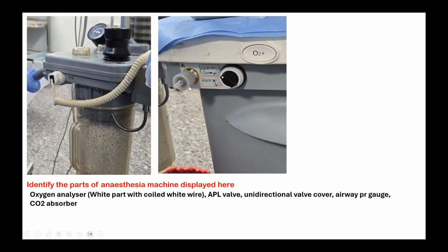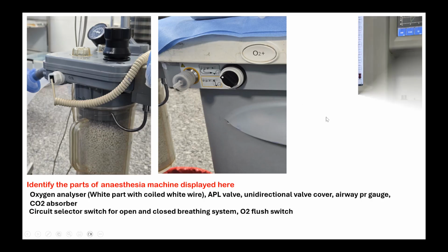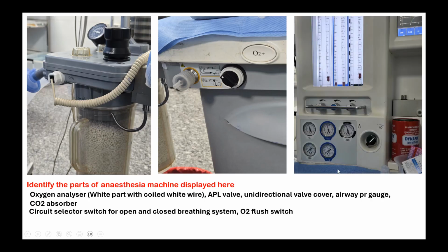Open-close system switch. It's a switch to select between rebreathing and non-rebreathing, a circle system and an open system. So this is the circuit selector switch for open and closed breathing, and the oxygen flush valve switch. This is again a picture which you have already seen, but can you identify all the parts in this?